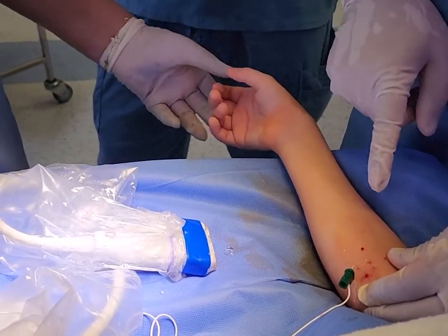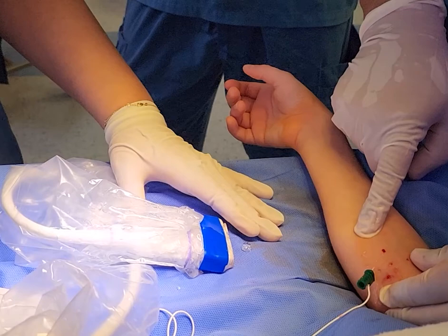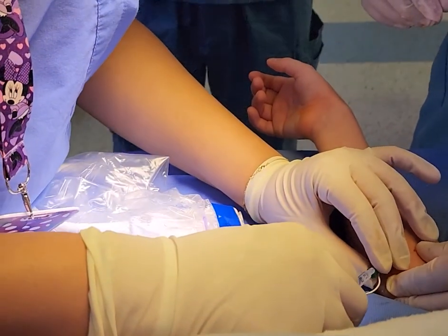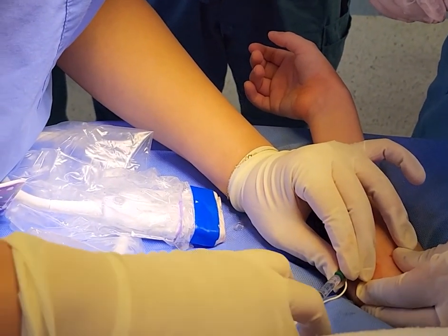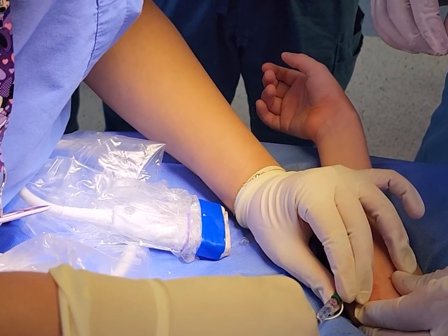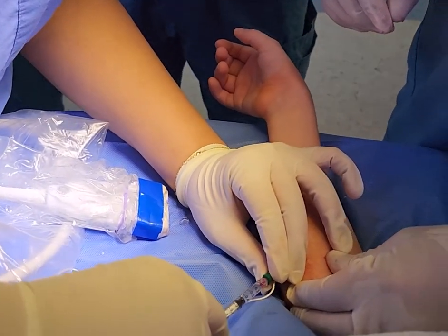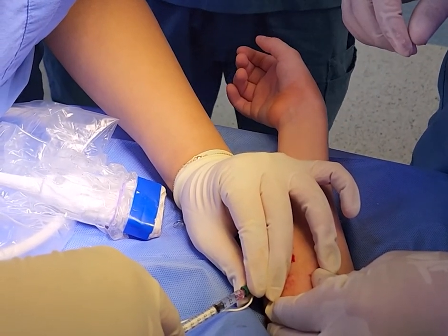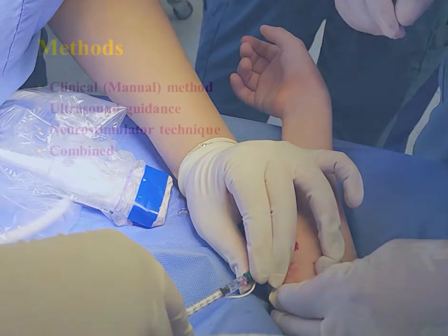Once I'm confident I'm stimulating only the flexor digitorum profundus, I inject the botox. With all methods, always hold the needle tight before connecting the syringe so you don't advance it by mistake. Aspirate before you inject to ensure no blood is coming — confirming you are not injecting into a vein or vessel — then inject the calculated amount into the muscle.